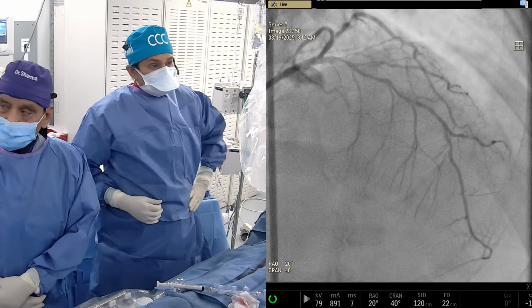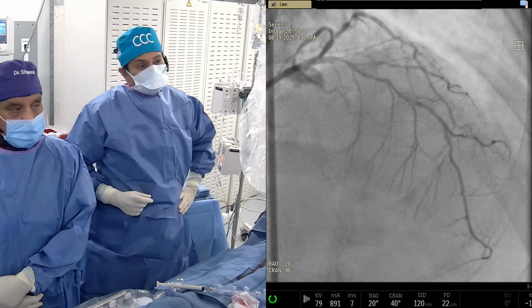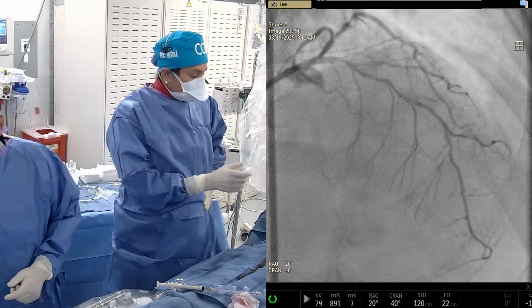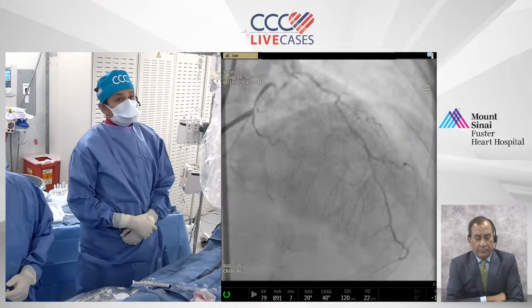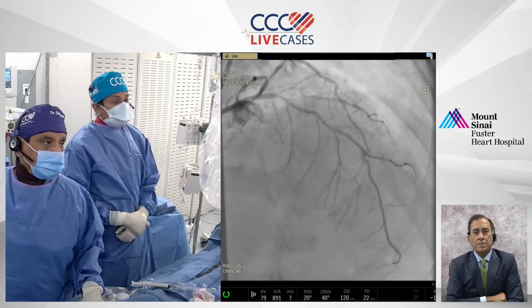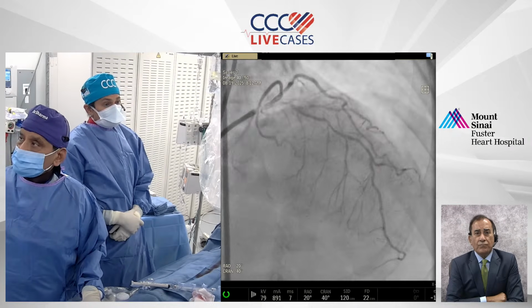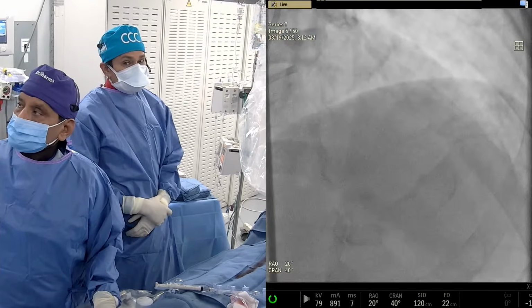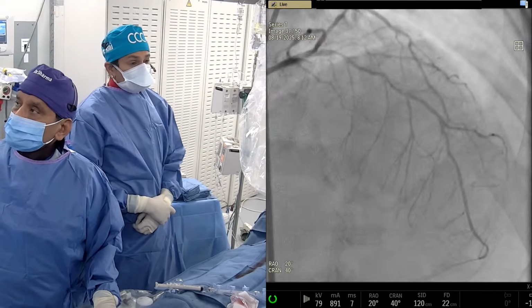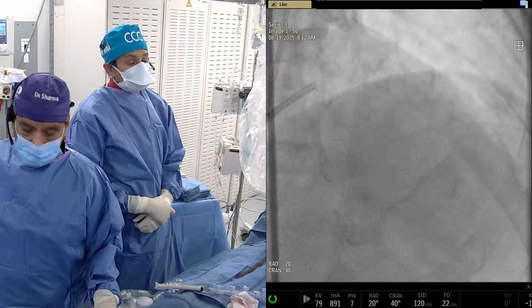So, there is a 95% stenosis, right? And the lesion length is about 20 millimeters. Right? Yeah. So based on your criteria, and there is mild to moderate calcium, it's likely we'll need a stent. There are two options: either do nothing, stent across, versus if you have to do something, once you do modification, pre-dilation, you may end up with the stent.